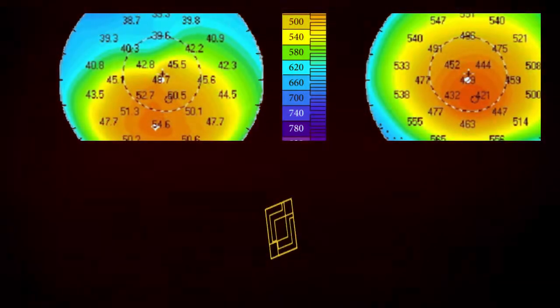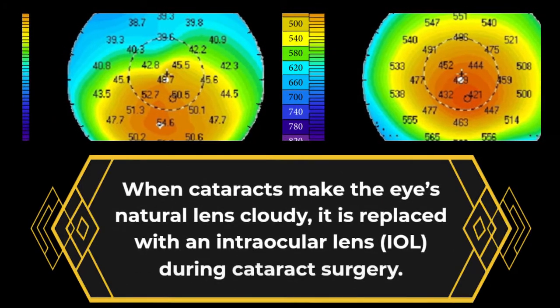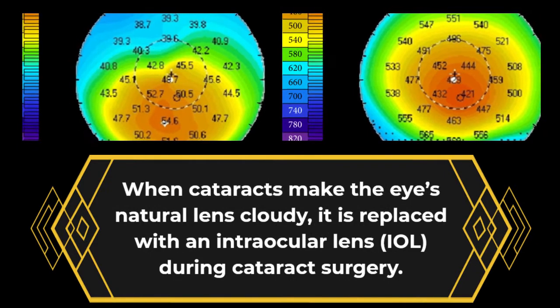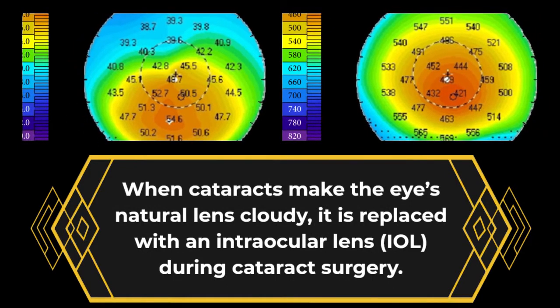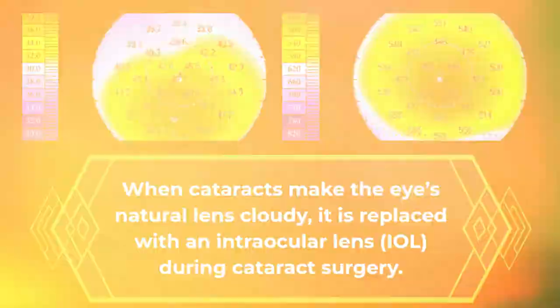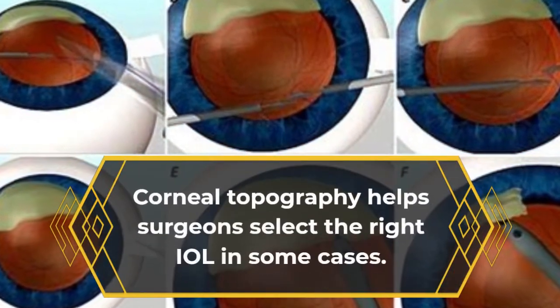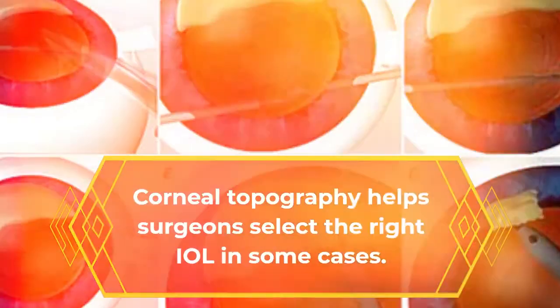When cataracts make the eye's natural lens cloudy, it is replaced with an intraocular lens during cataract surgery. Corneal topography helps the surgeon select the right IOL in some cases.